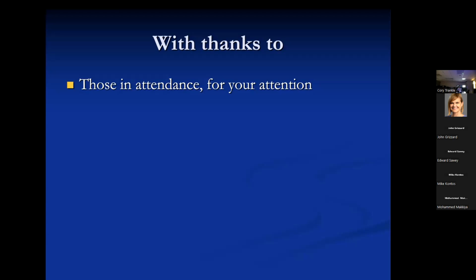Thank you, Dr. Grizzard. Yeah, I'm sorry. I'll just add one other thing. Because they're not built up over multiple beats, a real-time image probably has a better chance of showing them, because it'll actually show that frame by frame thing. You're not segmenting it. You're not obtaining parts of each image. You're getting it all at once.